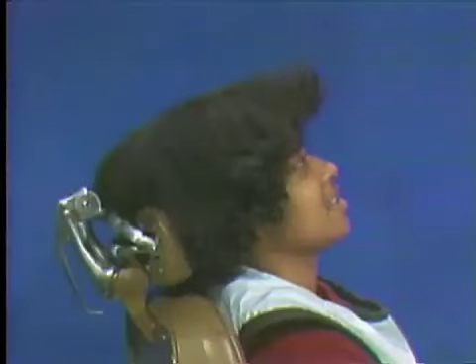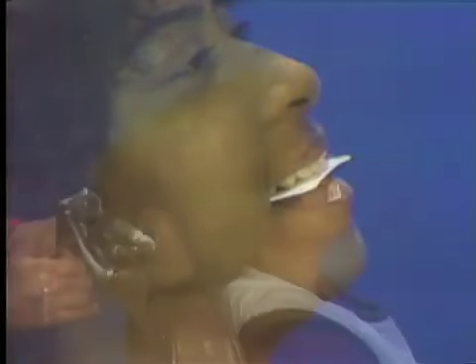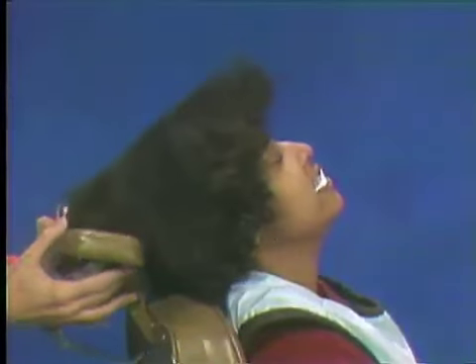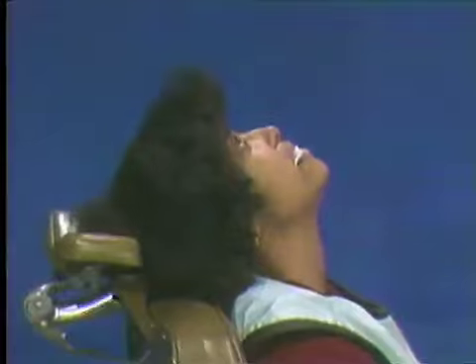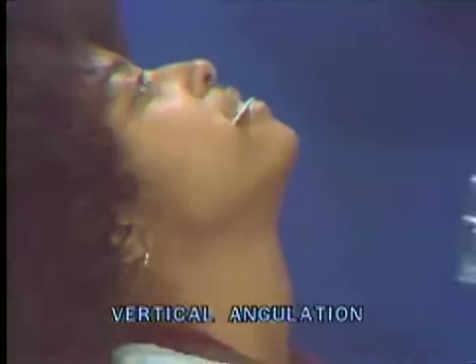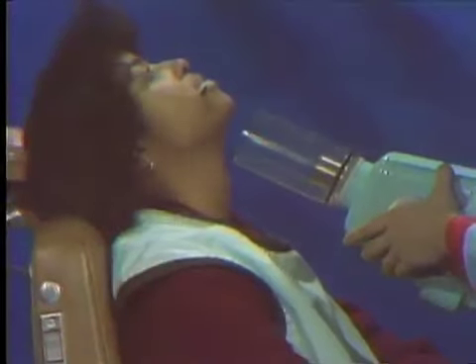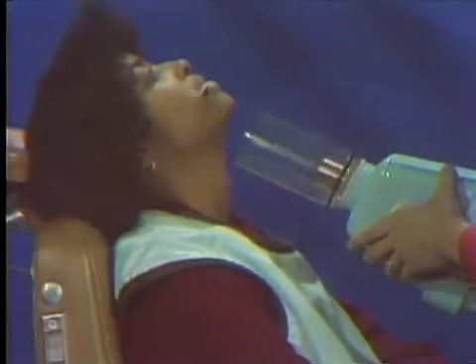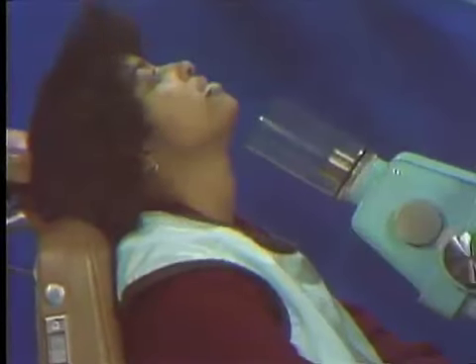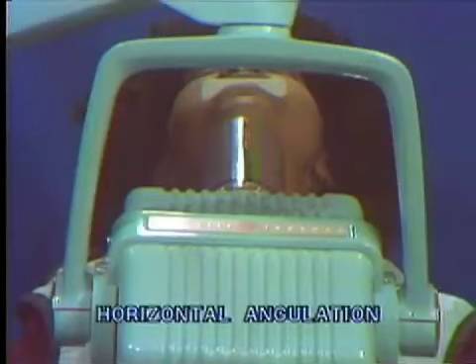The film is positioned on the occlusal surfaces of the teeth with the sensitive side facing the mandible. The long dimension of the film extends across the mouth instead of anterior-posteriorly. The patient tilts the head backward as far as possible. To select the vertical angulation, the central ray is first directed perpendicular to the plane of the film, so the open end of the x-ray cone is parallel to the film. The vertical angulation is then increased 10 degrees in an upward direction in an effort to project the central ray up the root canals of the teeth. The horizontal angulation follows the median sagittal plane.